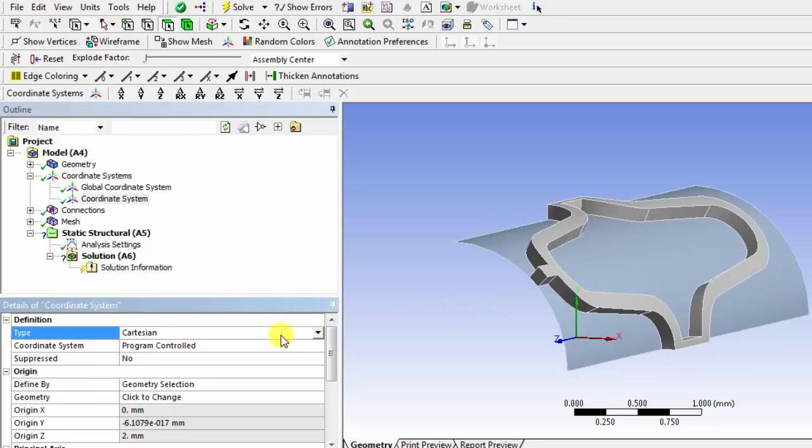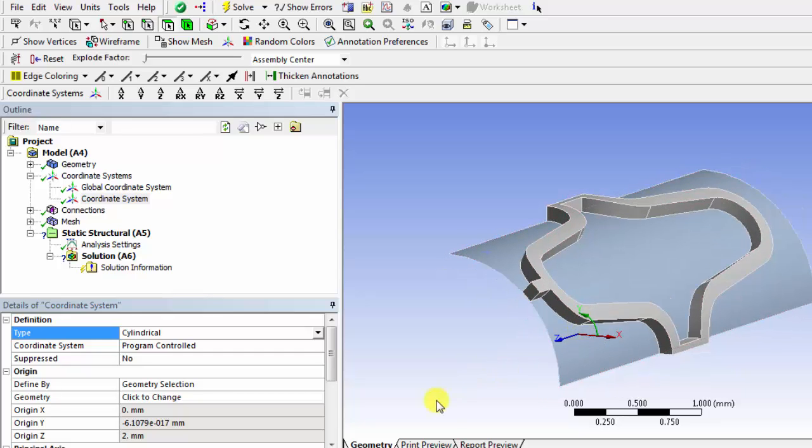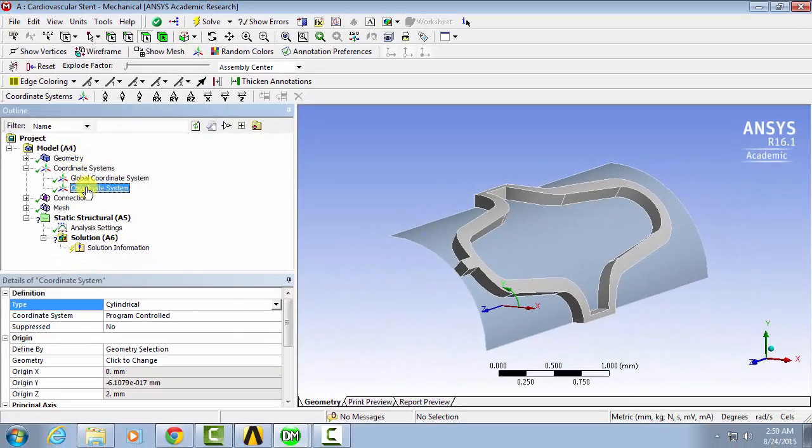From here, just change the type from Cartesian to cylindrical. And then now we'll define X as the radial direction, Y as the theta direction, and Z is still the lengthwise direction. And then we'll just rename the coordinate system to polar so that we can find it easily later on.